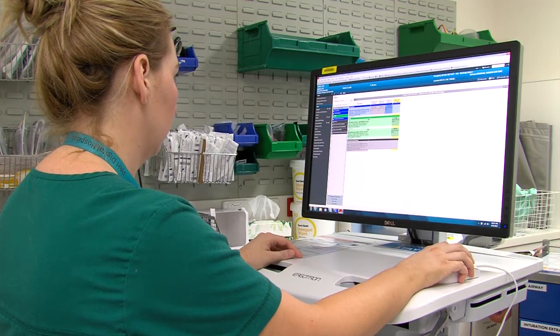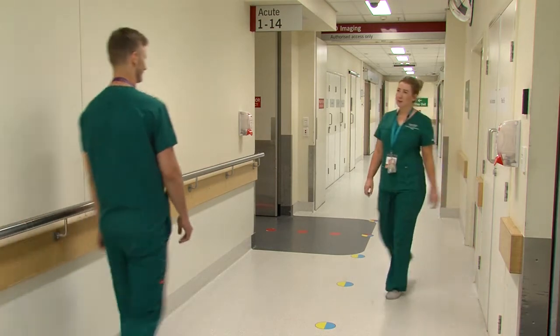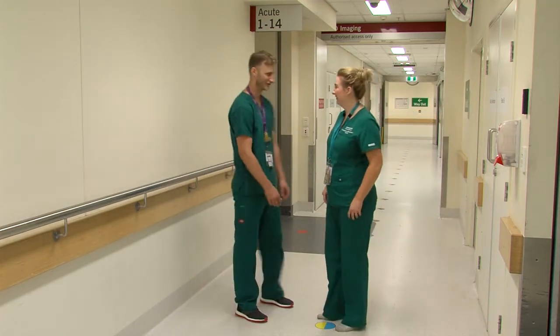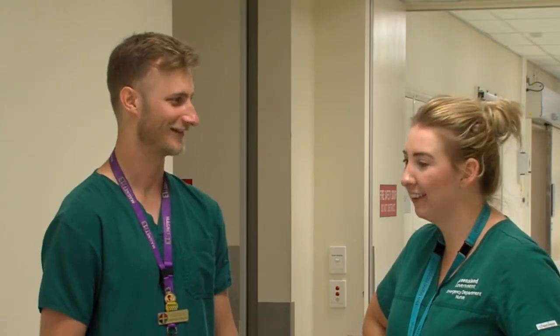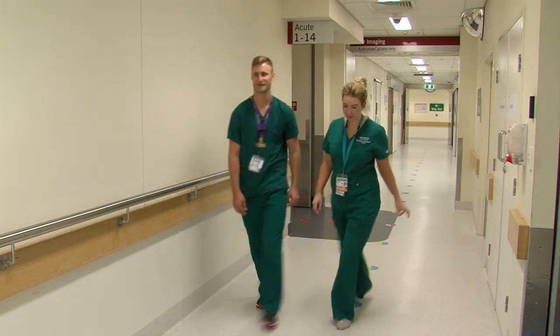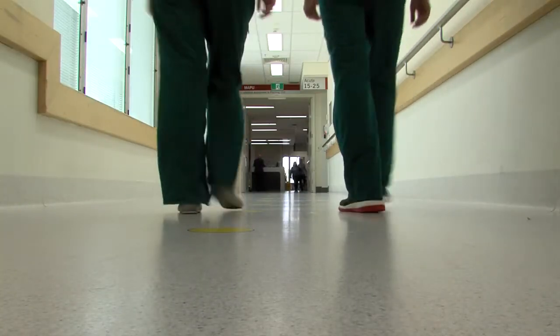Would you mind giving it to her? Sure. Thanks. First, the nurse must check the order and allergies on the IEMR at the bedside. The nurse then attends the medication room to dispense the medication from the Pyxis med station. Two nurses are required to sign for the removal of a controlled medication. In the PA emergency department, the witnessing nurse must be triage competent.